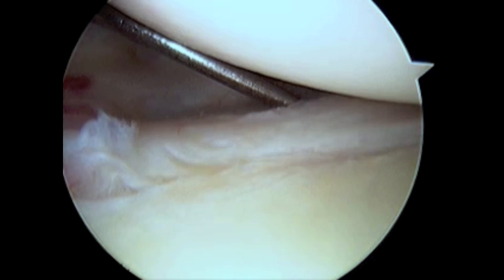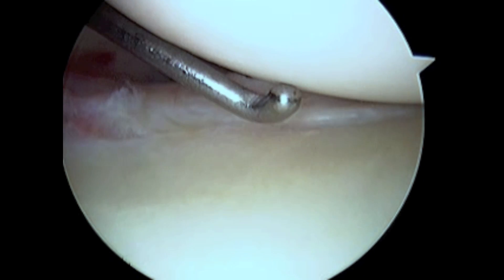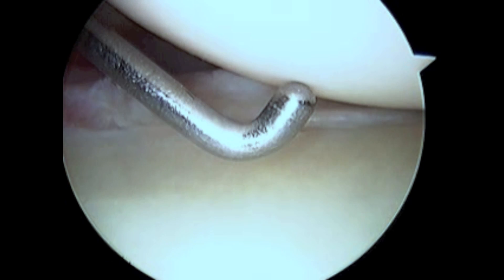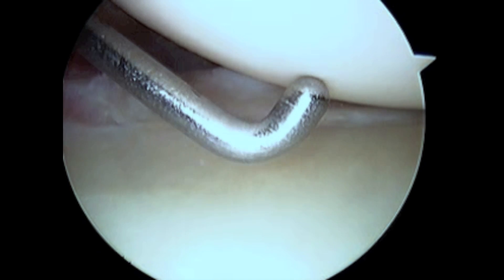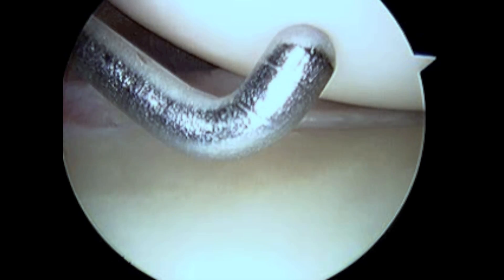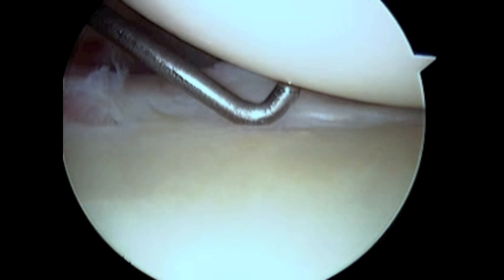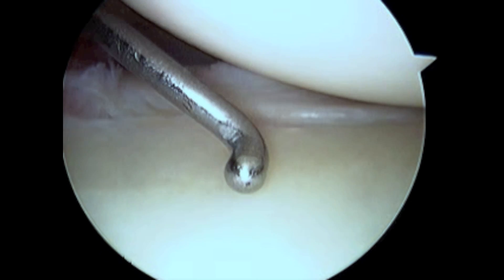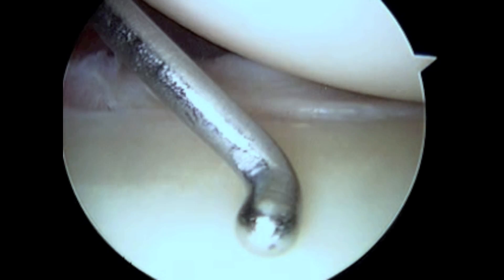We then evaluate the articular surface of the humeral head and the glenoid fossa. This is the ball and socket of the shoulder joint. As you can see here, there is no evidence for degenerative change or acute injury to the joint surface.